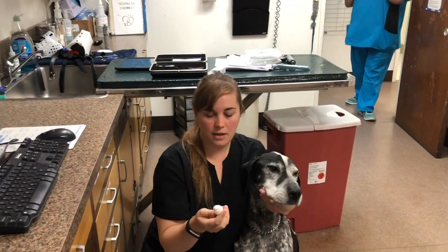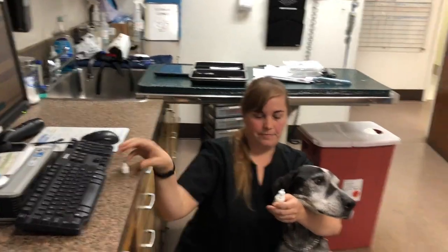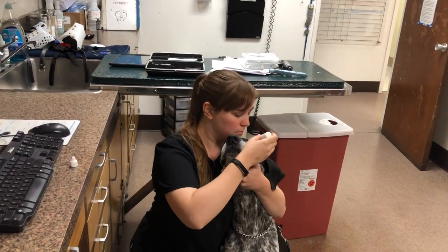We're good to go. I'm going to place proparacaine in my patient's eyes for the Tono-Pen. Just a drop in each eye.